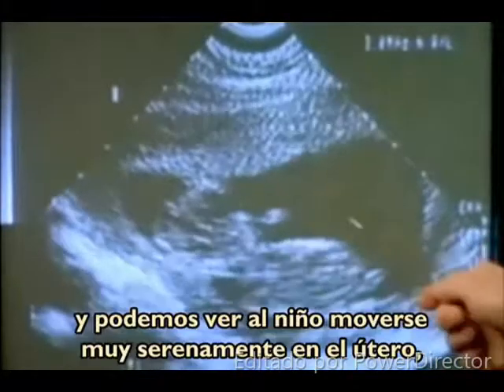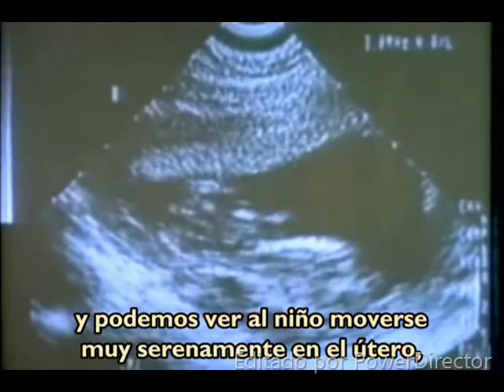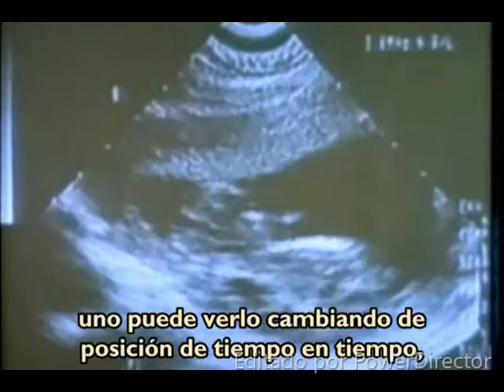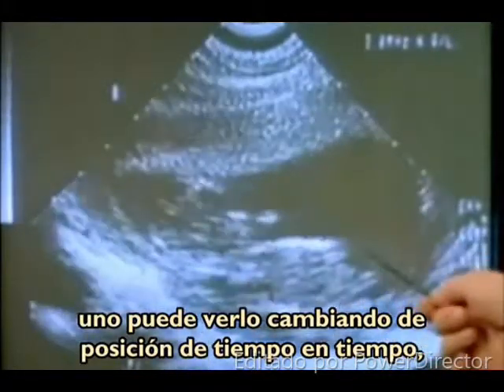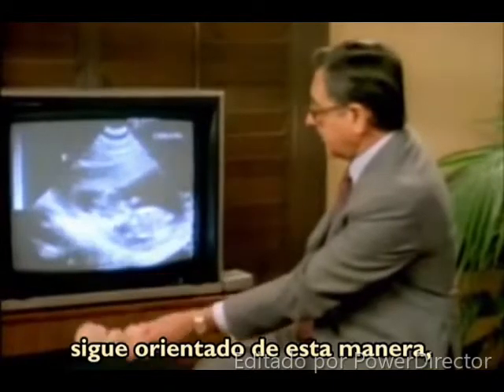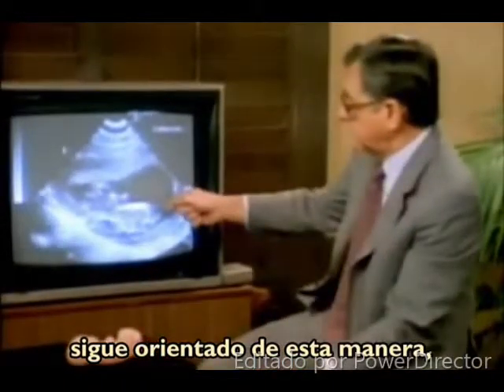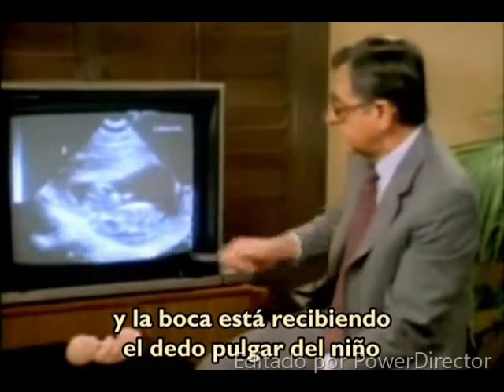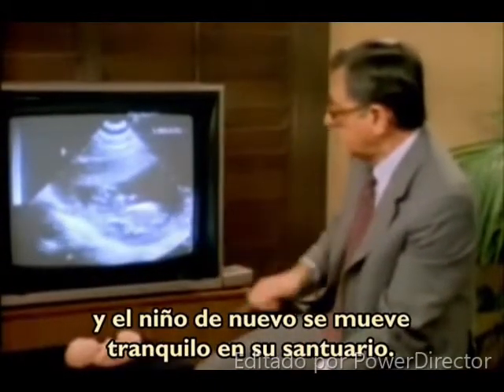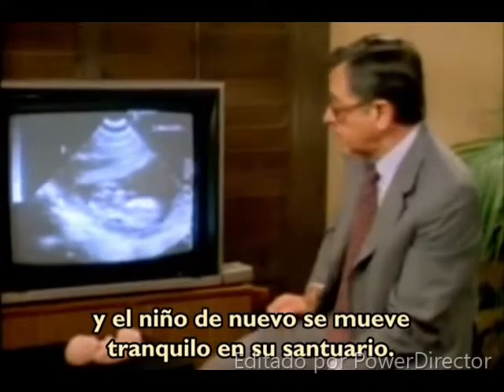The heart is beating at a rate of approximately 140 a minute, and we can see the child moving rather serenely in the uterus. One can see it shifting position from time to time. It is still orientated in this manner, and the mouth is receiving the thumb of the child. The child again is moving quietly in its sanctuary.